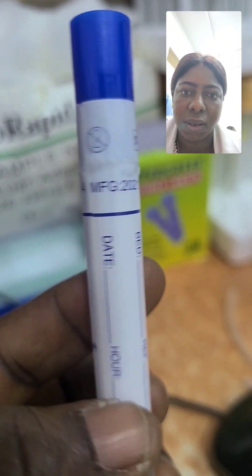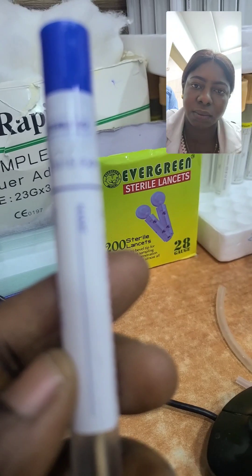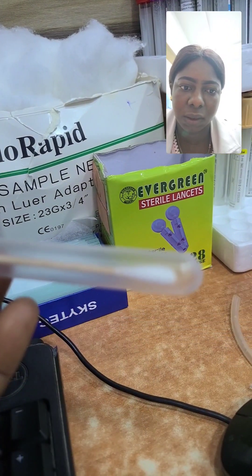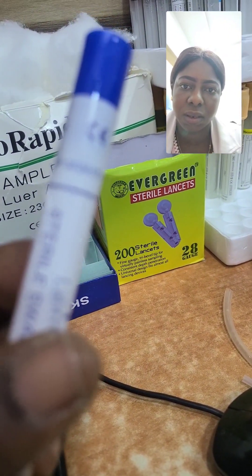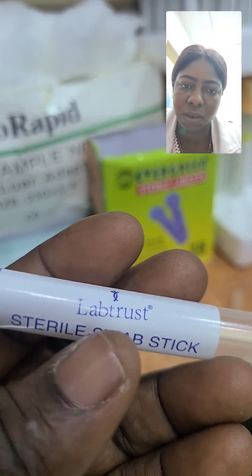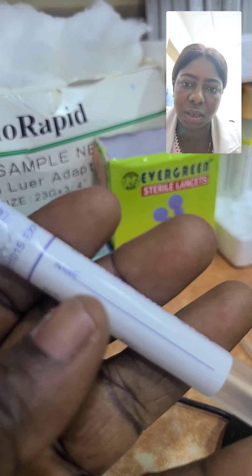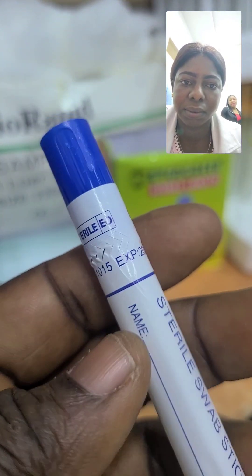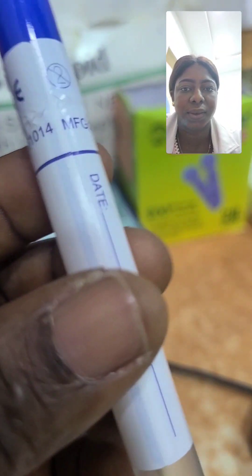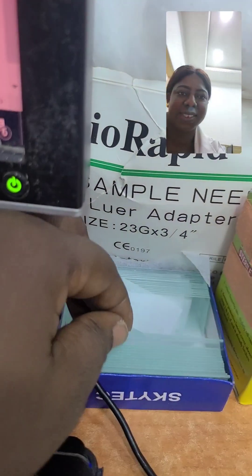This is a swab stick. As you can see, it is sterile and not yet opened. We use the swab stick to collect samples — wound swab, urethral swab, nasal swab, vaginal swab — different types of swab tests. We use it to collect the sample before we culture it. It can only be opened when you want to use it.